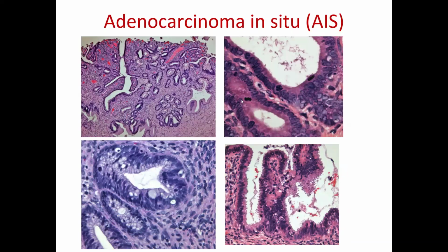Let us get higher power here. What is wrong with this gland here? This gland has large nuclei. They are crowded. See here how they are elongated. They are pencillated. They are jumping on each other. There is stratification here. I don't know what these guys are doing. You start to see some apoptotic bodies, but you see mitosis. This should be enough for you to call it adenocarcinoma, at least adenocarcinoma in situ. You look here. They maintain the lobular architecture. So now it is an in situ process.